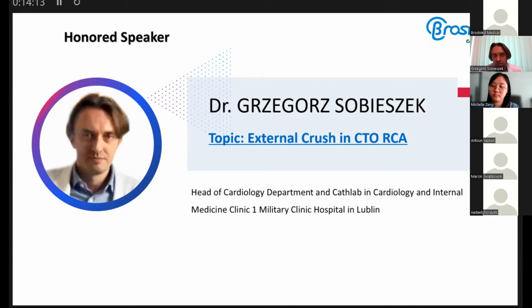From the previous presenter's great lecture, we have many possibilities, of course, but we must remember that in an uncrossable lesion or in a CTO lesion, the best, fastest, simplest way, when we have wired the vessel, is just to go with a small balloon, and this is the best solution.